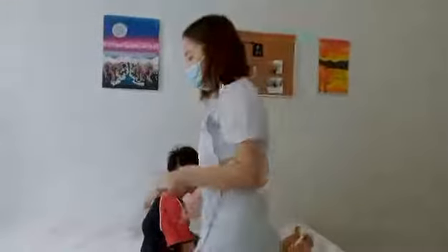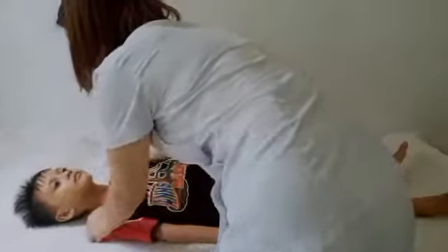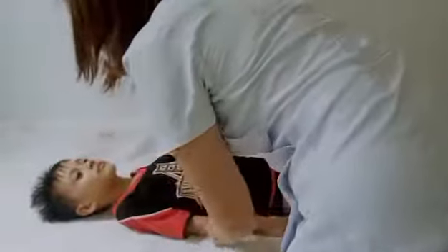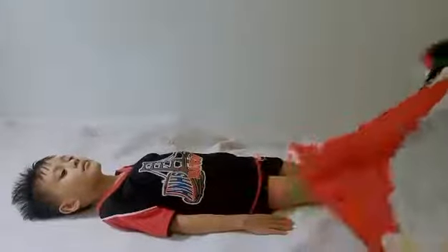Of the patient. Place the patient in a supine position. Then, center the mid-sagittal plane of the body to the midline of the grid and adjust the shoulders to lie in the same horizontal plane. Place a support under the knee for the patient's comfort.